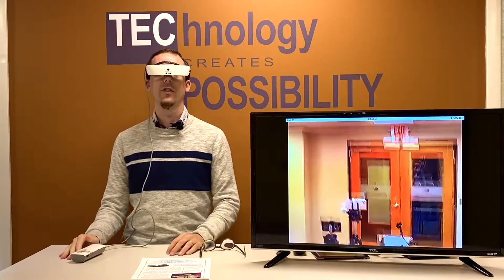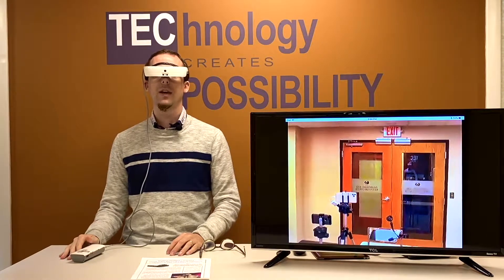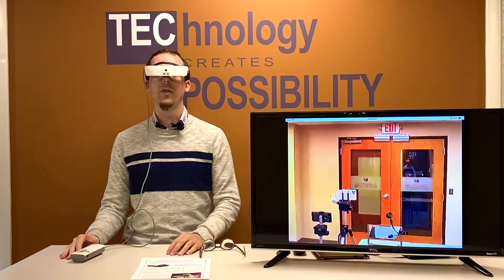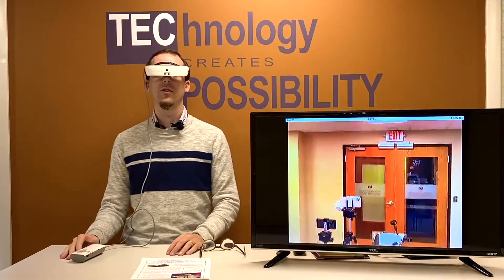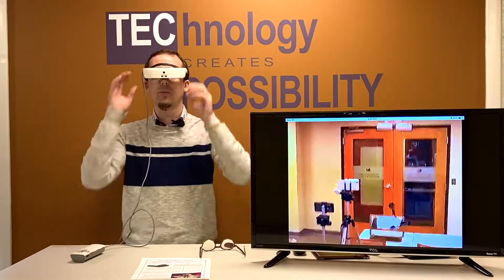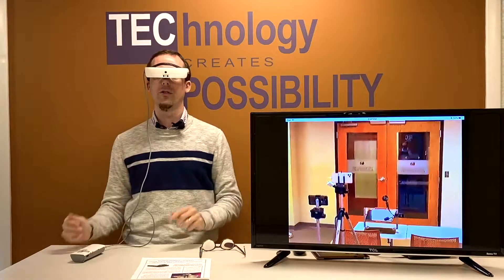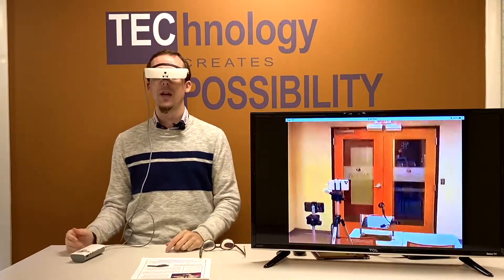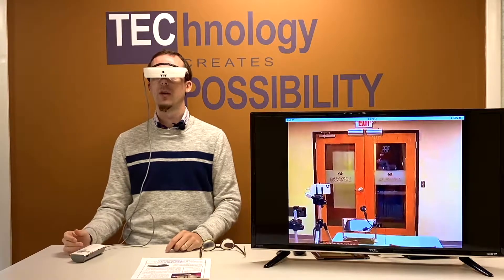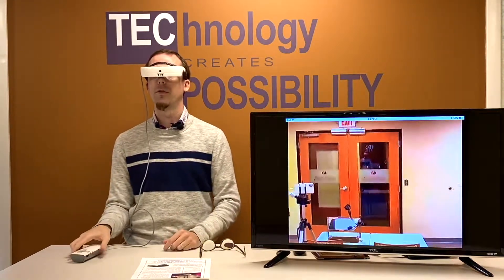eSight is designed for people who are low vision — it does not work for people who are blind — and it's designed to enhance the existing vision of people with a visual impairment. One of the ways that it does this is magnification. There are two video screens inside the glasses, one for each eye, and there's a camera in the front. Wherever the camera points it will send that image to the screens.